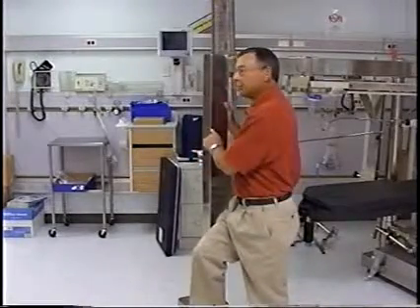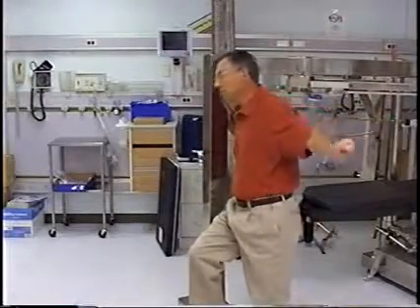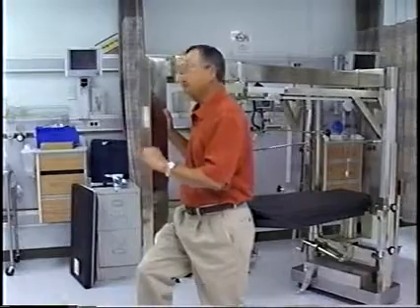Agreed. When I do orthopedic in-services, the first thing I tell people is the one cardinal rule. The one cardinal rule for orthopedics is that anything you loosen, you retighten. And you'll see that on any fracture table you use, whether it's this one or our new one or anybody else's, there's going to be lots of parts and pieces that you have to loosen, set up, and then retighten.